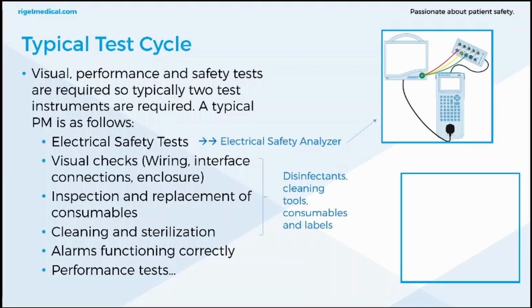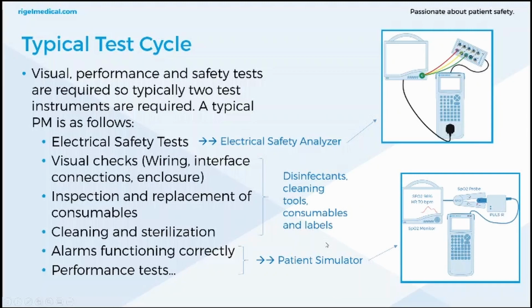Then we've got visual checks: wiring, interface connections, enclosure, inspection and replacement of consumables, cleaning and sterilisation, alarms functioning correctly. And for this, you're going to need disinfectants, cleaning tools, consumables, and labels. And finally, performance tests. You're going to need a patient simulator.